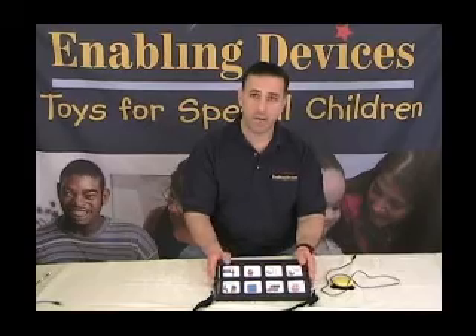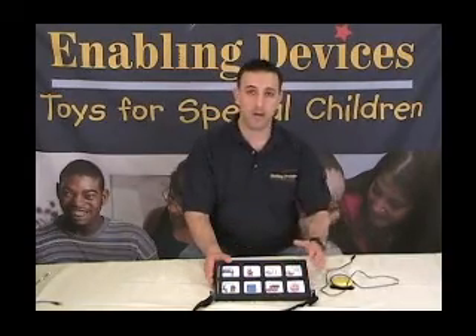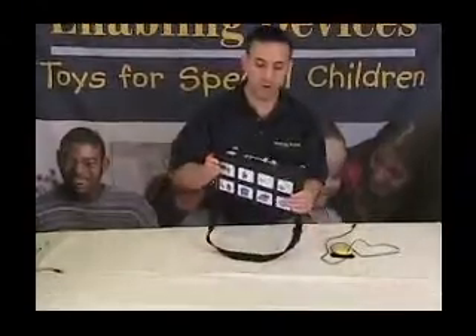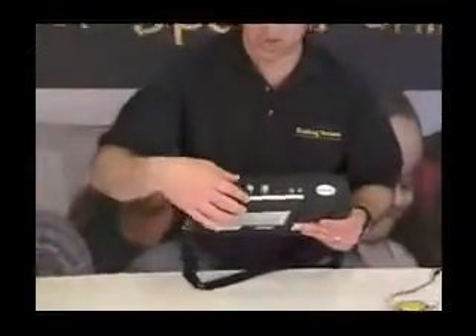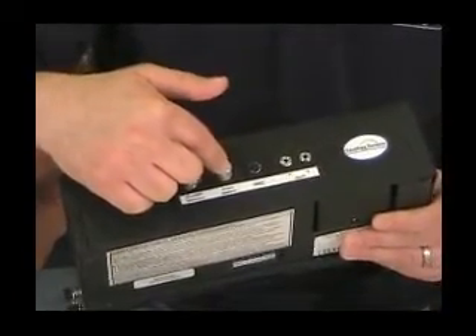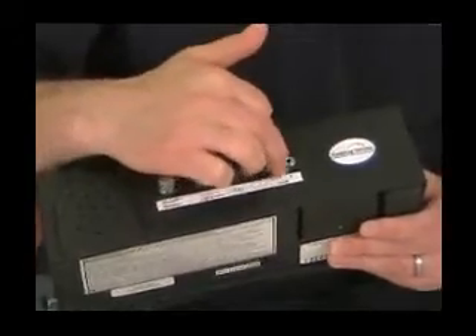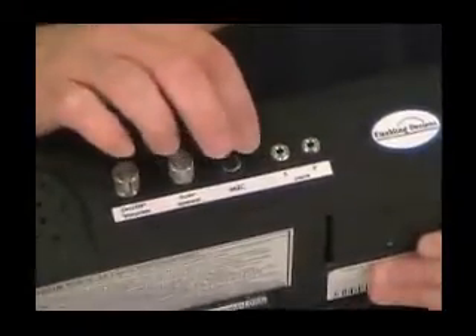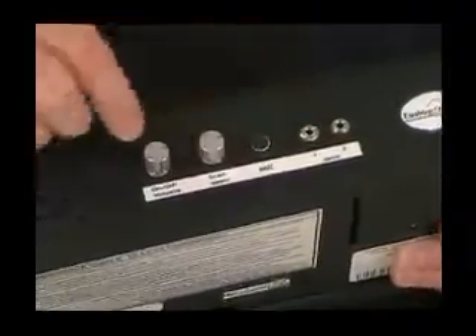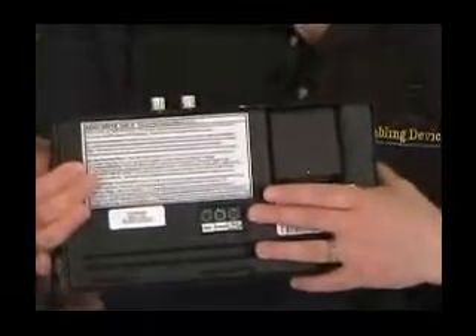This segment is going to focus only on the scanning portion of this device, not all product functions and features. Here's your on/off volume control and your scan speed setting so you can adjust the scan speed. You have jacks labeled jack one and jack two for switch one and switch two. Switch one is used for the single-switch modes, and switch two for the two-switch mode setup. On the bottom, you have the auditory cueing button to turn that on and off at any time.